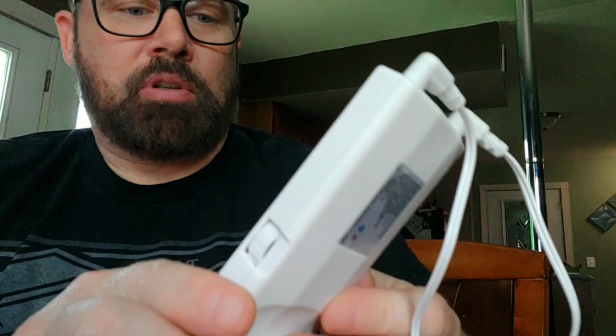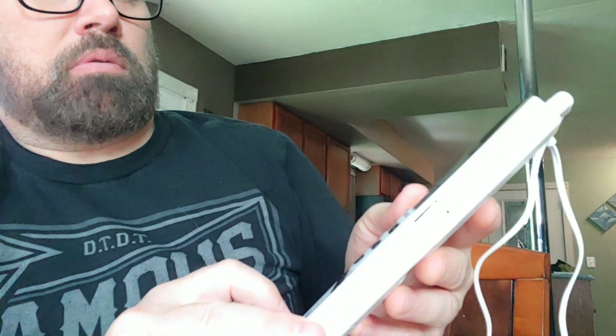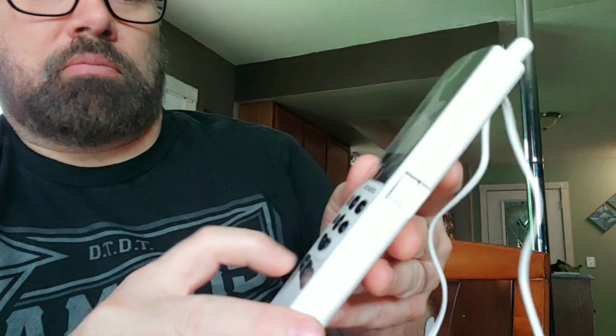I still don't feel anything. Okay, that seems to be on 10. I don't feel anything, so maybe I have to do something else here. Let's start it back down on 1, and let's push massage. Yeah, I think that's doing something. I don't feel it, but it's apparently doing something.